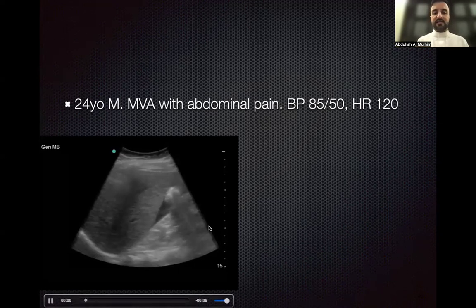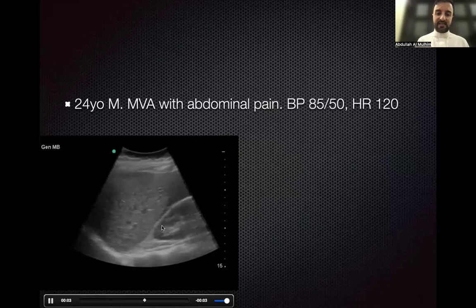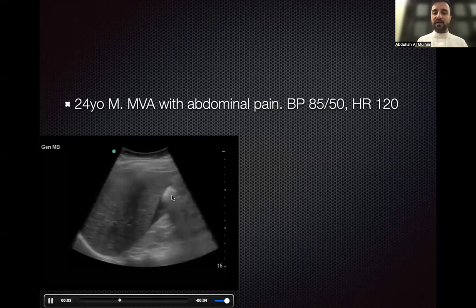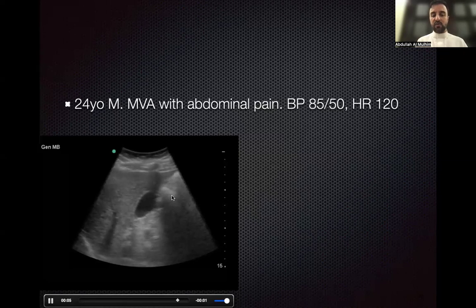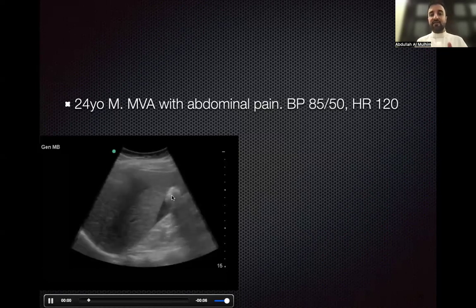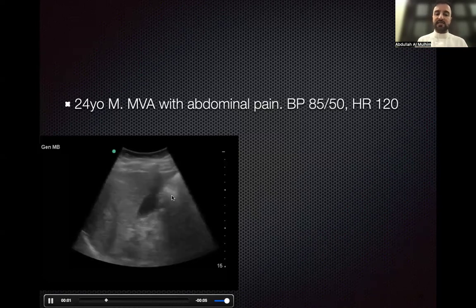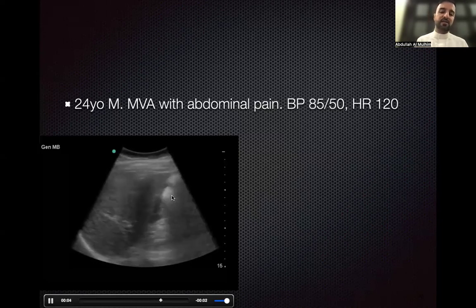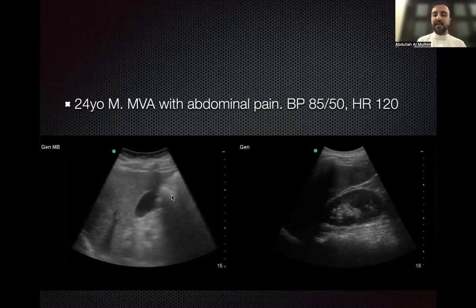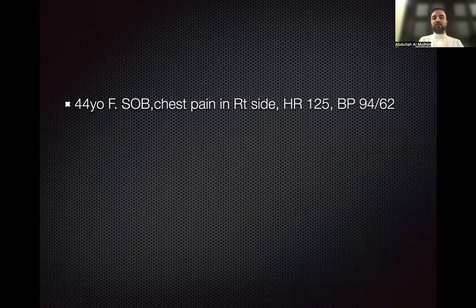So what you are seeing here is the right upper quadrant ultrasound, which shows free fluid in the Morison's pouch or hepatorenal pouch, which looks hypoechoic or anechoic and can represent free fluid. So this patient probably needs proper resuscitation and can be taken to OR immediately. If this patient is unstable, usually those patients will never be stable enough to be taken to CT scan, so this patient should be treated immediately by taking them to OR. This is the scan on the right side, which is a normal scan for the same application. So this is the use of a FAST scan for those patients, which can help you in managing them.